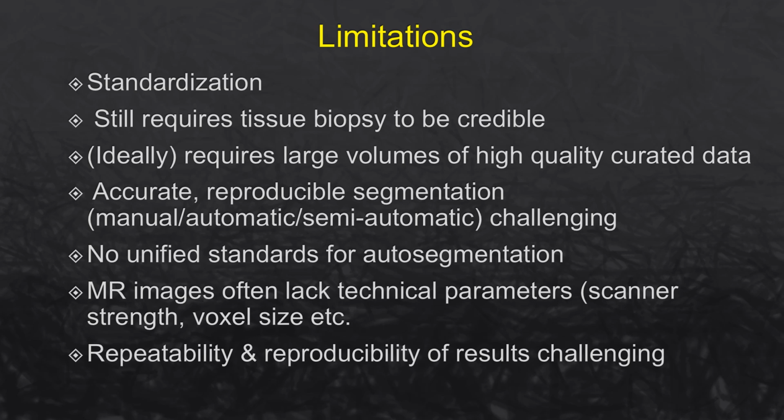Evaluation systems have been proposed, comprising weighted metrics to determine the workflow completeness, the model quality, and clinical adaptation potentiality of radiomics studies, something called radiomics quality scores, or RQS. And these are going some way to standardize this area of research.